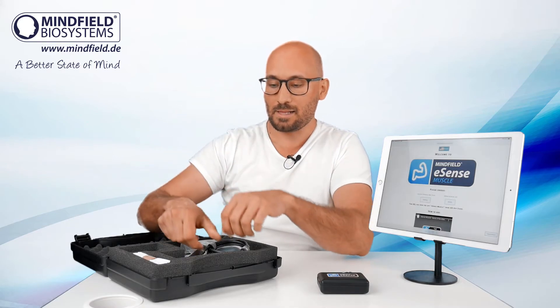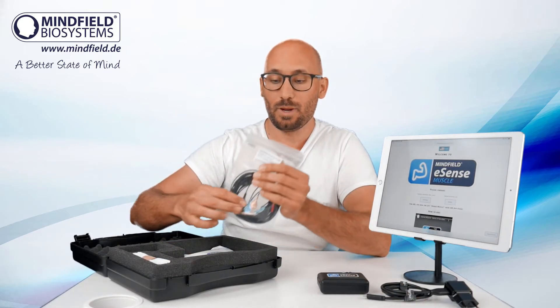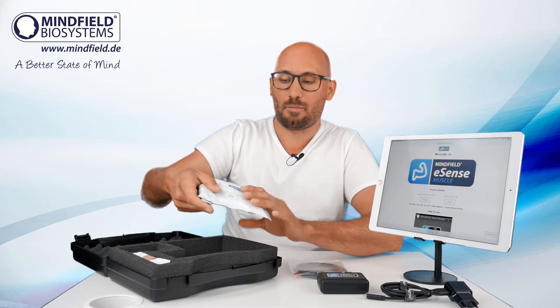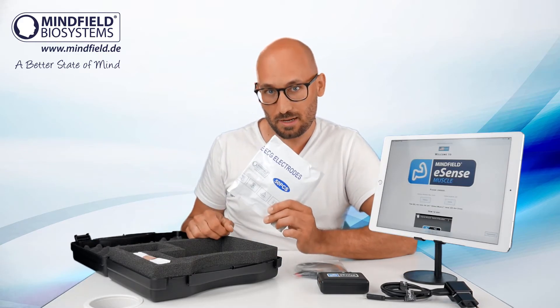Every platform is supported and possible. In the box we also have a charger, electrode cables with standard snap button connectors, and a package of 50 disposable surface EMG electrodes.